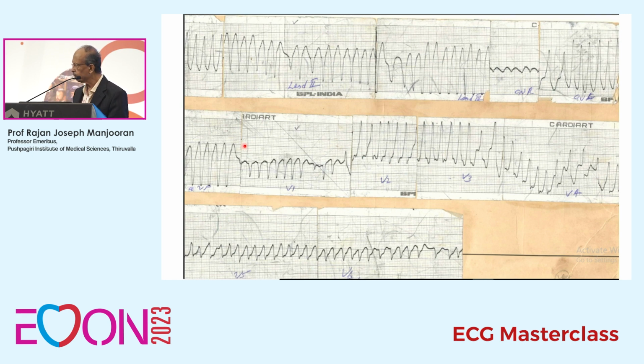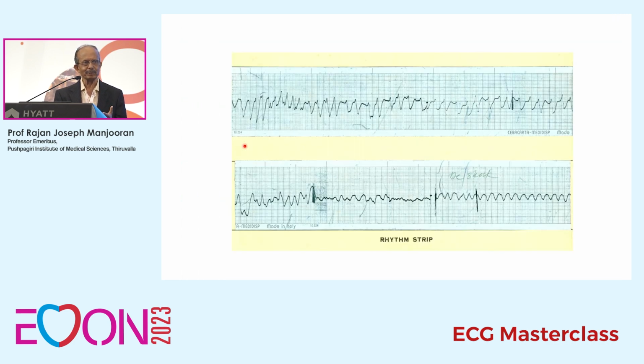Just one more minute. When I have finished, you just tell me, I can stop. And I can continue for any length of time. So when it is time, you just let me know, I will stop. Okay, so this is because I have brought about 70 electrocardiograms, so it does not matter.